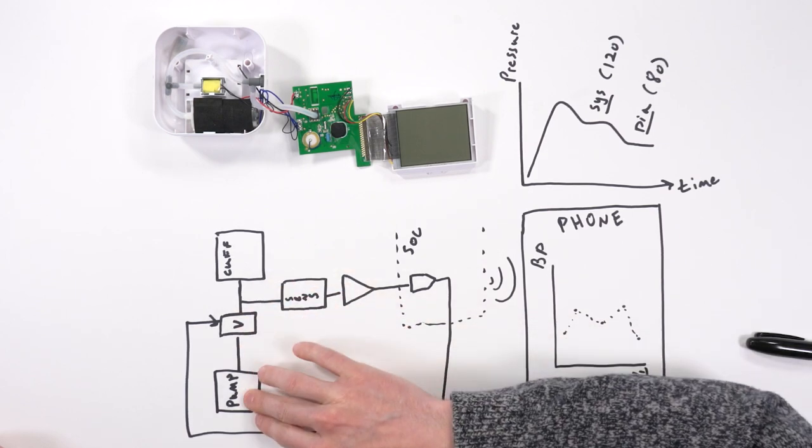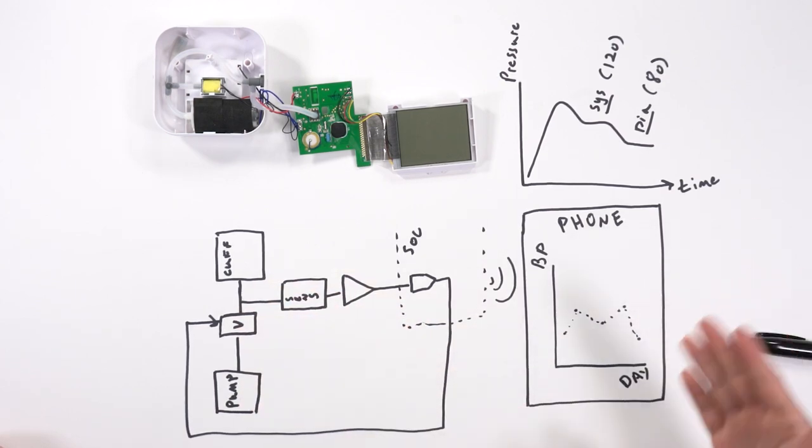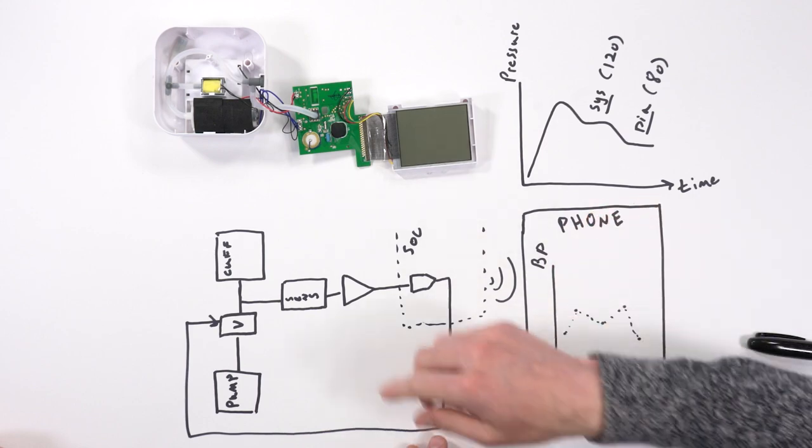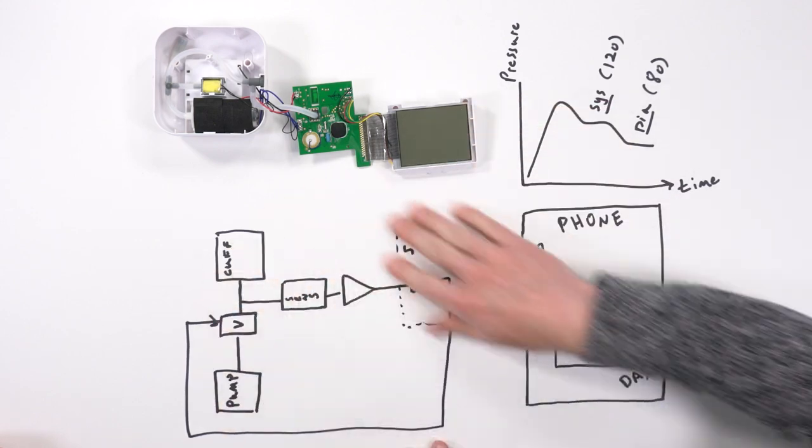And then on the other side of the valve is the pump that's actually pumping the air into the cuff to close off your blood. So here we show the overall system.